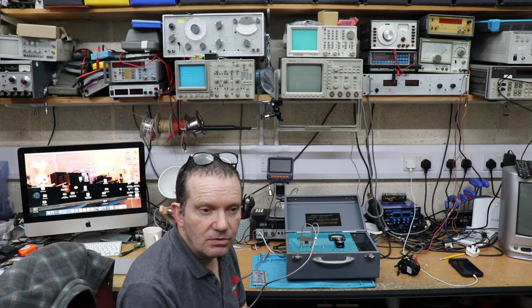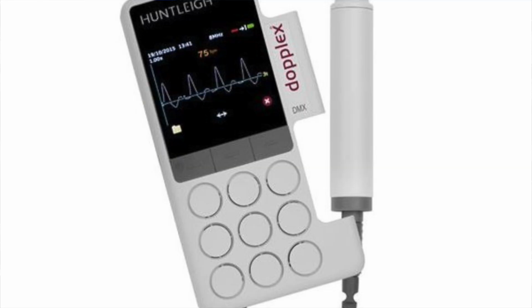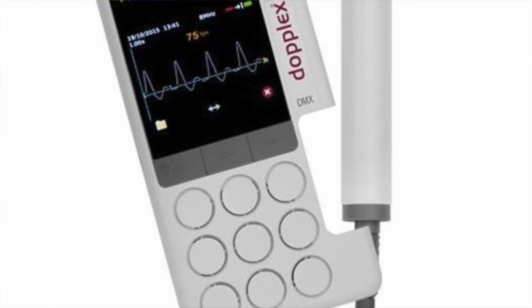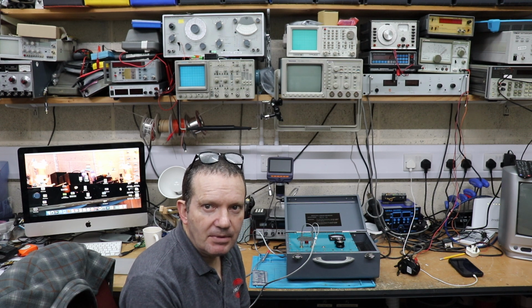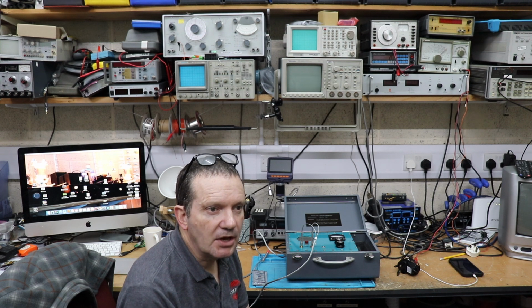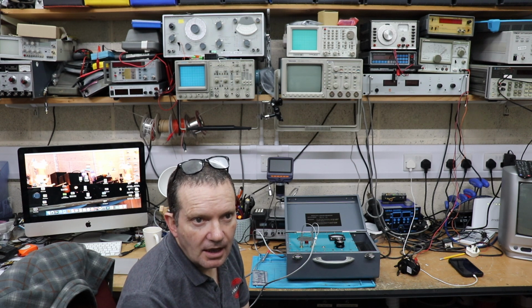Now the ones that we use in the hospitals are not quite as big as this. They're more pocket size, quite modern pieces of equipment. They'll sit in your coat pocket. The majority of vascular units in the UK use them. They're made by a company called Huntleigh, which, from what I understand, is based not too far from here in Cardiff.